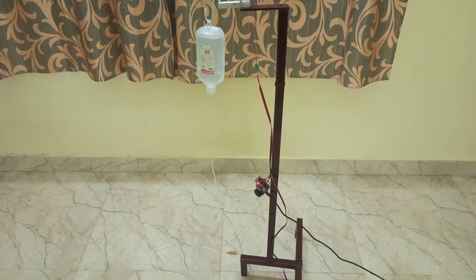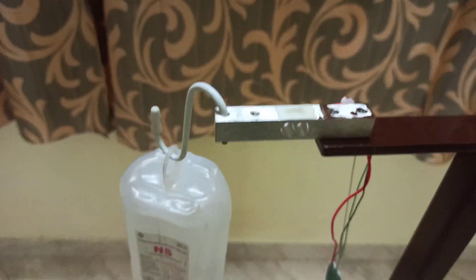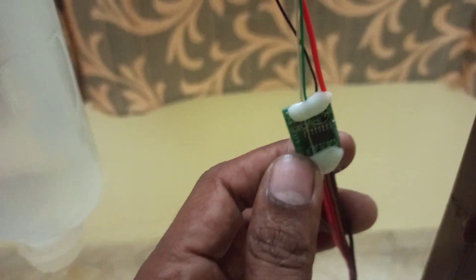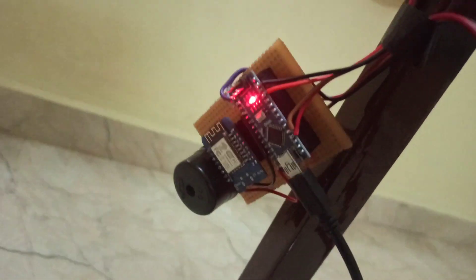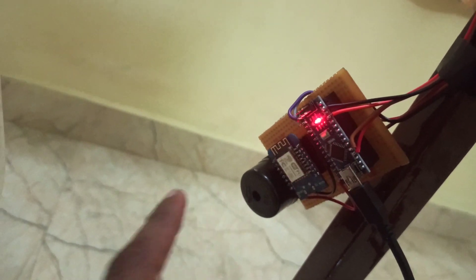The entire setup is ready. This is the load cell. I have fixed the glucose bottle to the load cell, and this is the load cell amplifier HX711. This is the Arduino Nano, the Wi-Fi module, and this is the buzzer.